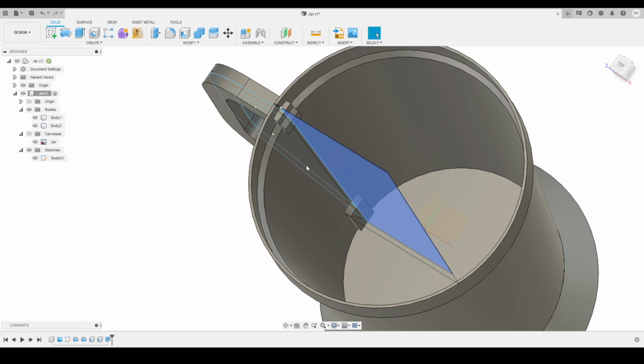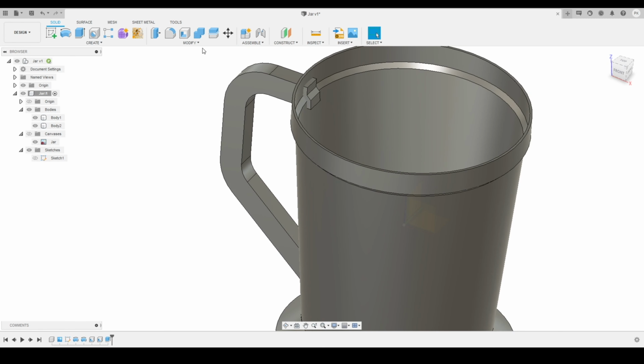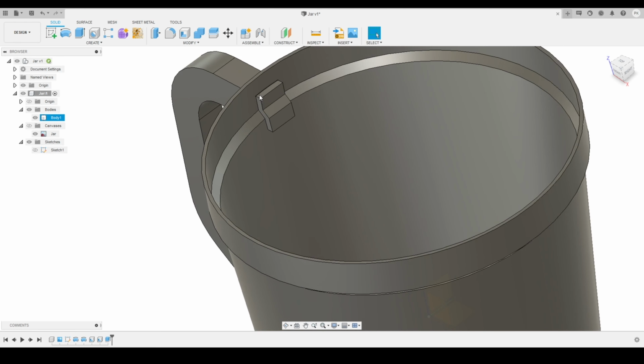Here you can see it is just crossing our main body, so don't worry about that. So I will again go back to our profile, because the operation in the extrude we had kept here as a new body, so we'll change that to join and we'll press OK. Here you can see both the bodies are joined now.